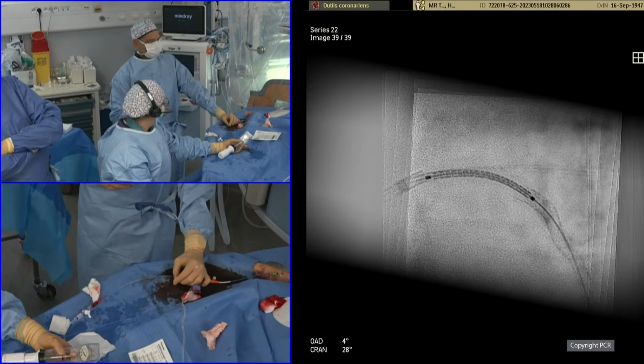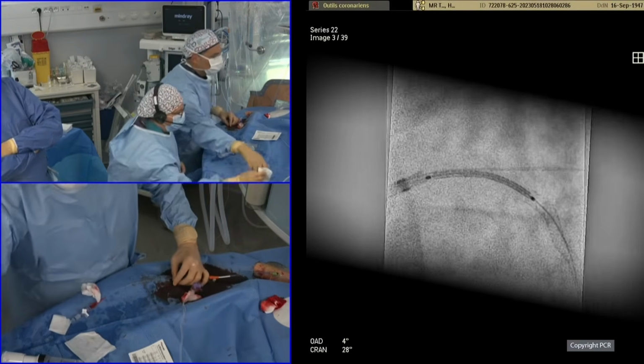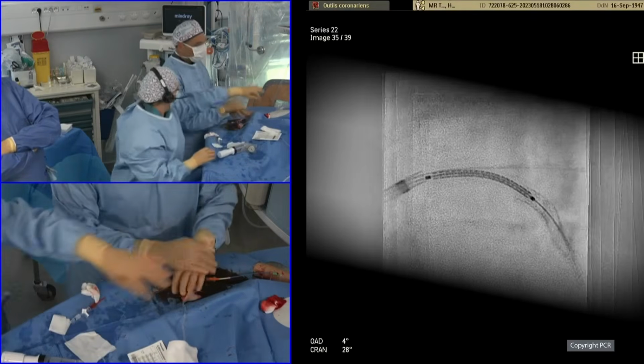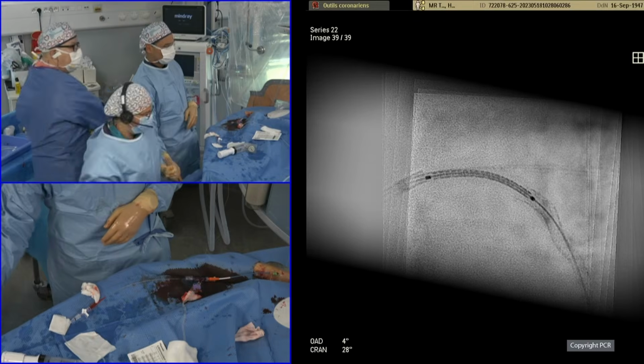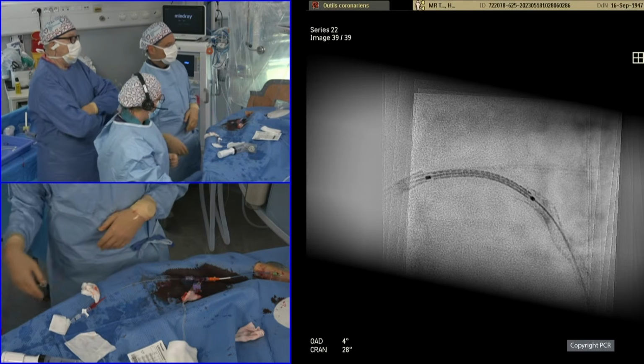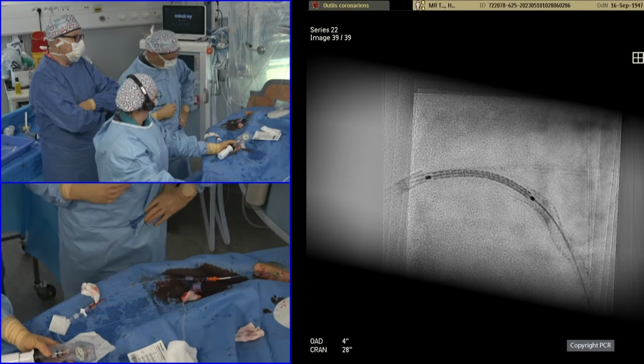We have some input, I think, from OFDI. We can have some guess regarding the ostium of the left main, which is relatively large. You can see on the angio that the circ is a bit aneurysmal. So I think we are now in a positioning of left main lesion.